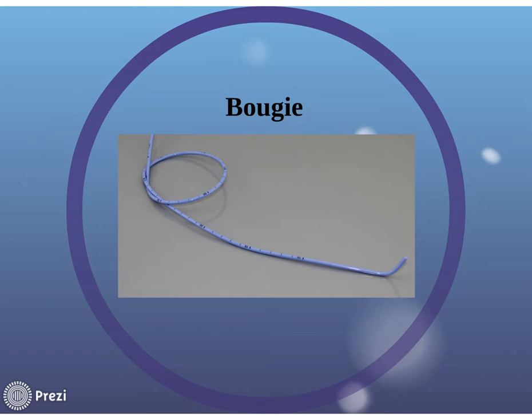Sometimes the end of the endotracheal tube gets stuck on those little bones, and so sometimes you have to turn the tube just a little bit to the left, typically, so that's counterclockwise, right? You know how the tube has a little beveled end? You just turn it a little bit to the left, and it'll get past those cords.